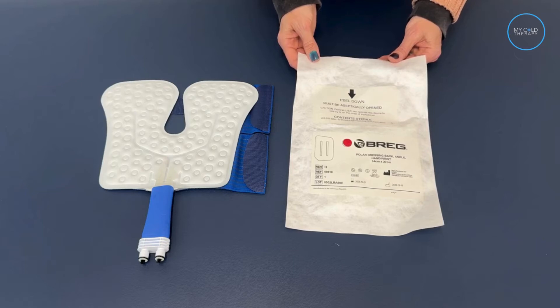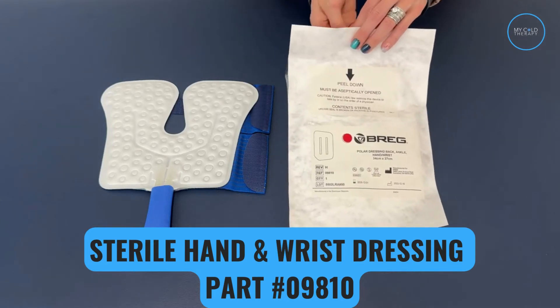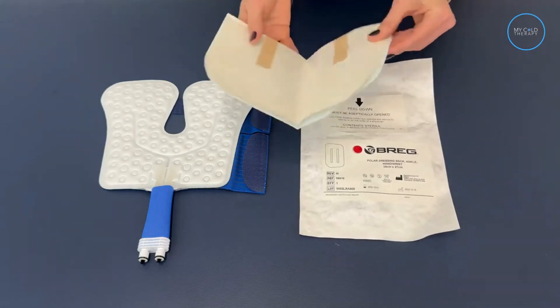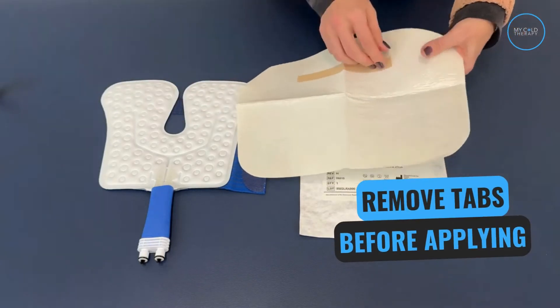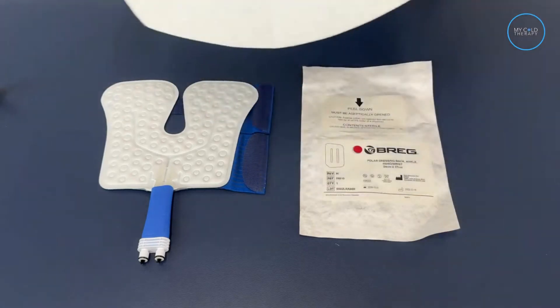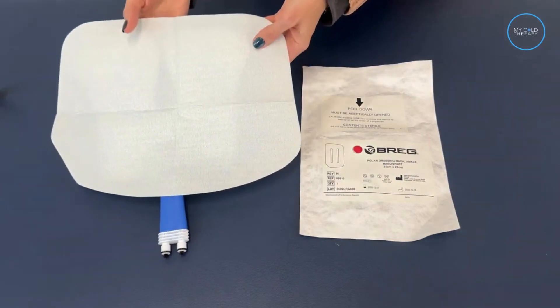They come in a sealed package and this is how you apply them. This is the hand and wrist dressing, which can be used on both the Cube and Kodiak hand and wrist pads. You're going to open the sealed package and remove the dressing. Once you have it open, you want to remove the tabs that are on the back. Once you've done that, you're going to place it on the pad, press down firmly, and then you are ready to apply it to your body part.